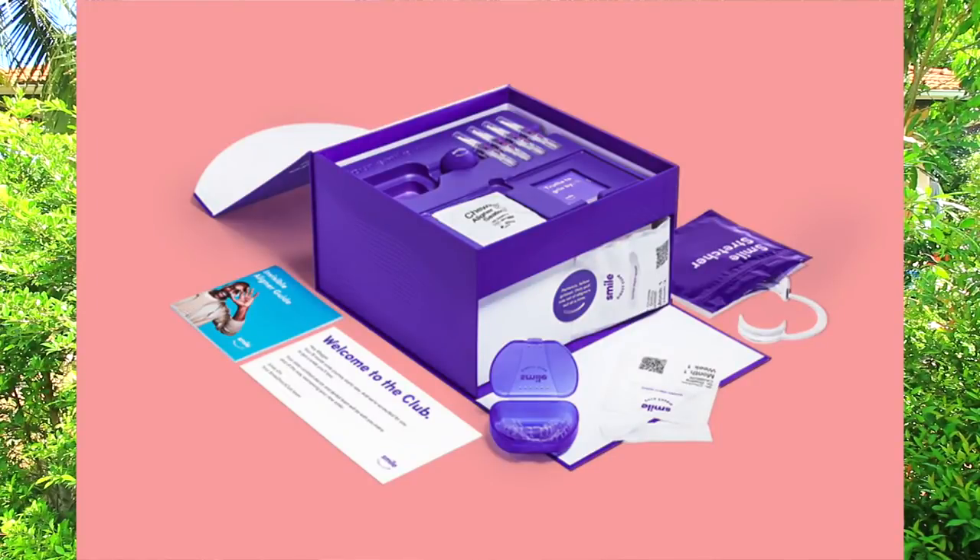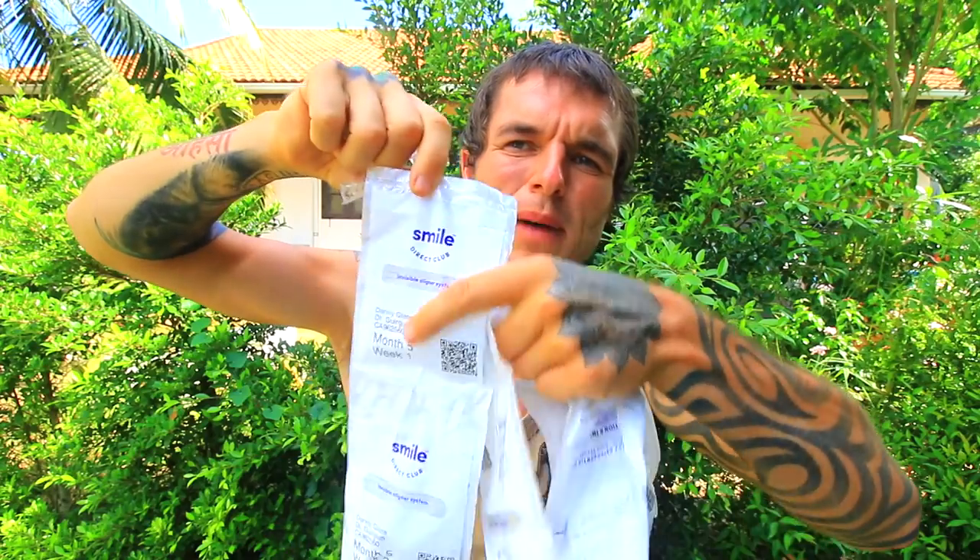When you get your kit sent to you, they're going to send you these packets — each one has the bottom and top braces in it. They give you a six-month supply, so each month you will have three different sets of braces to use. For example: month three week one, month three week two, and month three weeks three and four. It's gradually correcting your misalignment, just like every other type of braces out there.